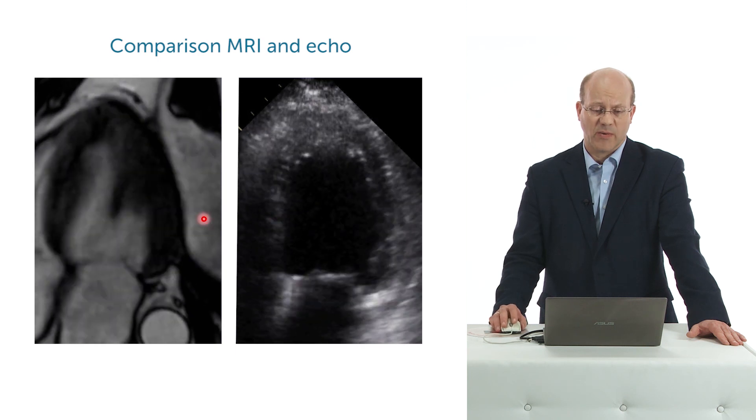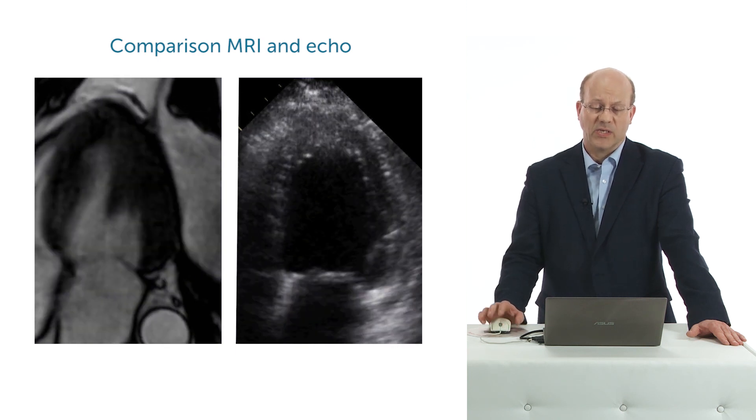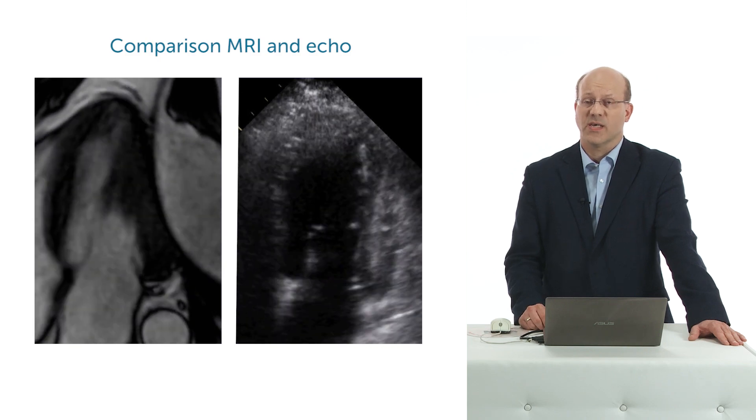And this is exactly the funny motion that we see in the echo image. If you compare the MRI image and the echo image directly, you see that they both show exactly the same motion pattern. So I think this is a nice example that you can also use deformation imaging to rule out disease. You see all sorts of strange things, and with speckle tracking you can sometimes get a little better understanding of what the problem really is.